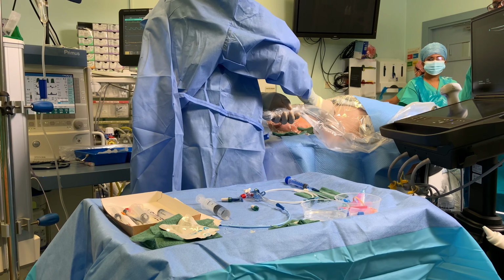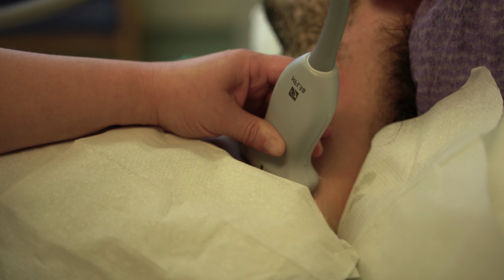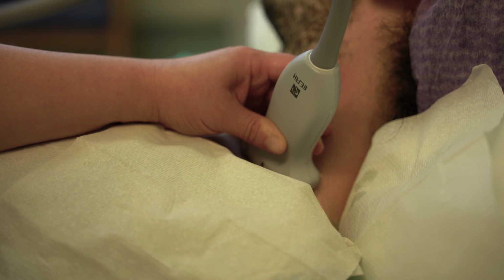When you place the probe onto the patient, think about how you're going to stabilize your scanning hand and/or arm in order to maintain steadiness and decrease fatigue. I always rest the ulnar edge of my scanning hand on the patient, ideally on a bony structure for stability, and then, where possible, my scanning arm on a surface like the patient bed or the trolley.